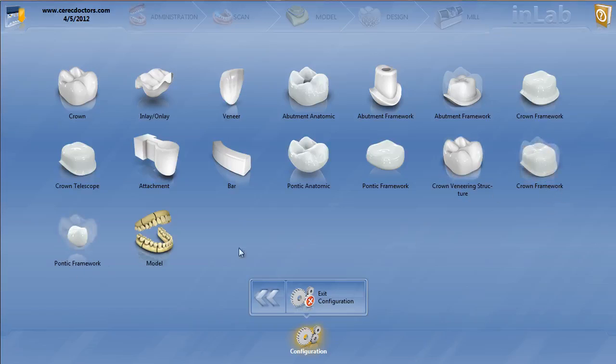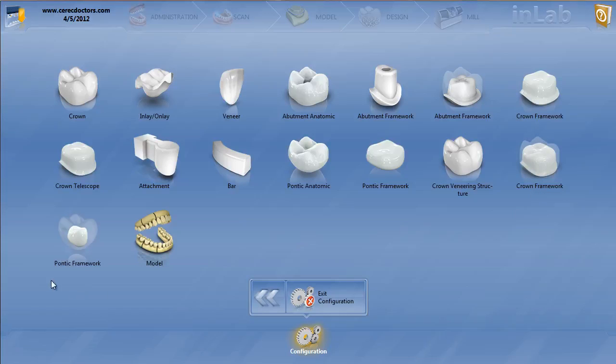So if you're doing a full contour or a three-unit EMAX CAD bridge, for instance, you design it full contour, reduce it into the frameworks. These will be your abutment frameworks for the crown framework, and the pontic framework parameter will be here. Now, the part that's reduced, meaning the veneering structure, will be the crown veneering structure.